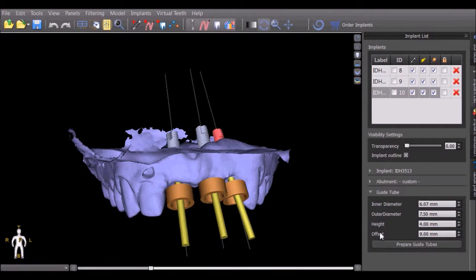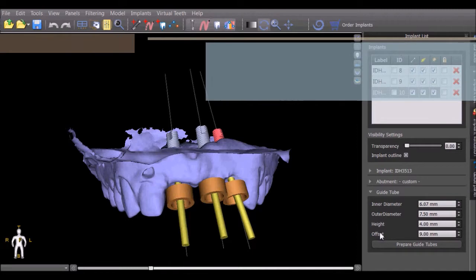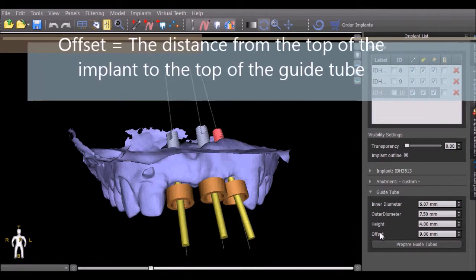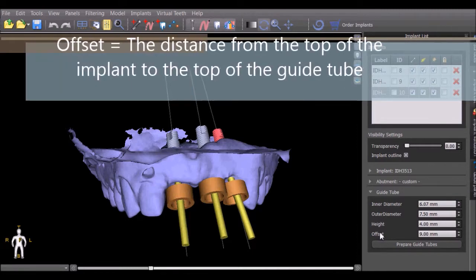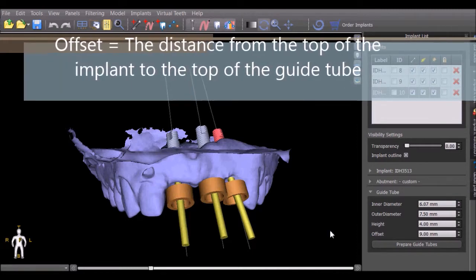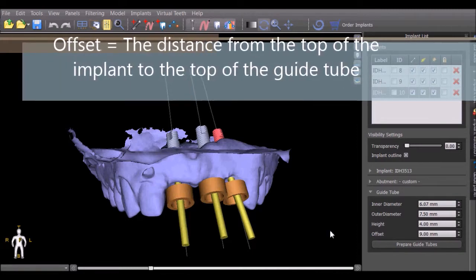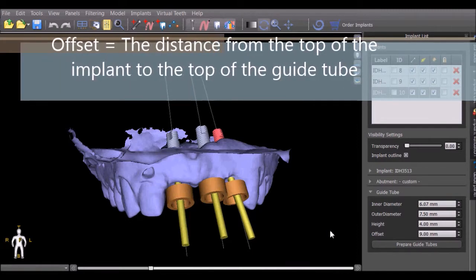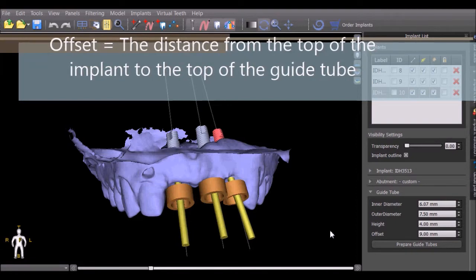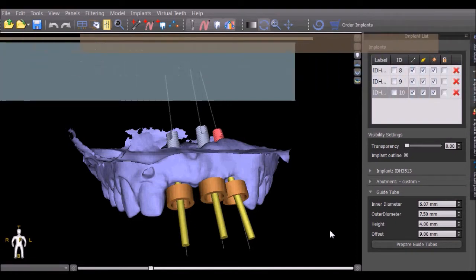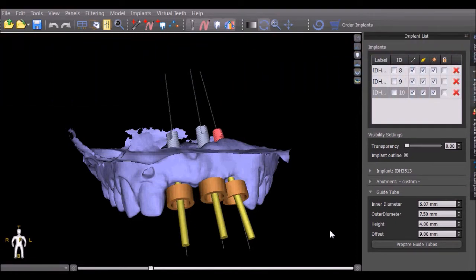The offset is the distance from the implant top to the top of the guide tube. This value can be changed to match the drill stop on the drill to make sure that the drill stops at the proper depth.